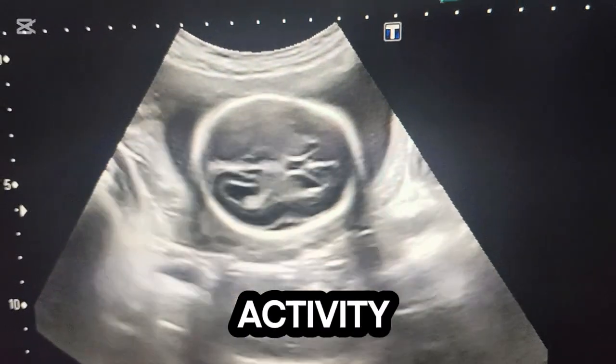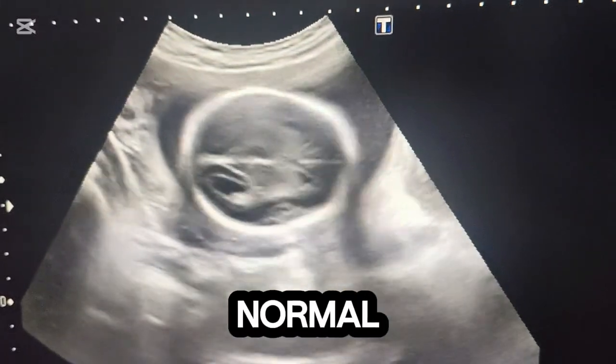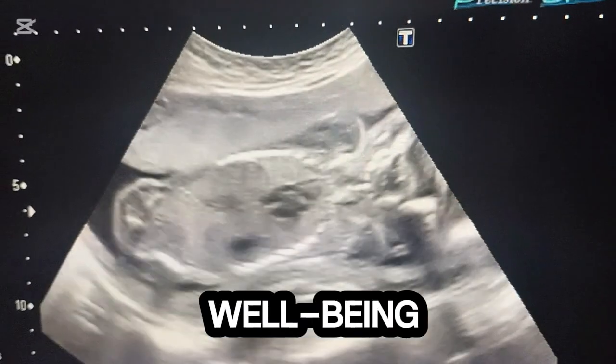Fetal cardiac activity shows rhythmic heart contractions, confirming viability. Normal heart rate between 110 to 160 bpm indicates healthy fetal well-being.